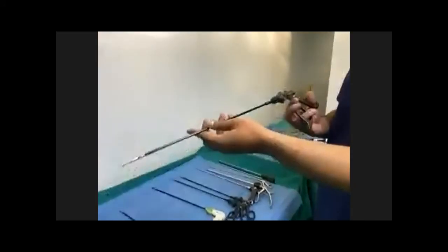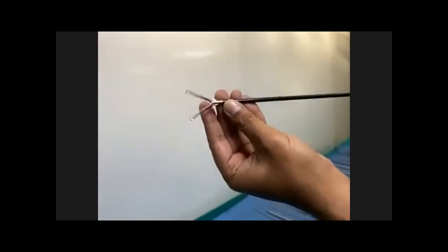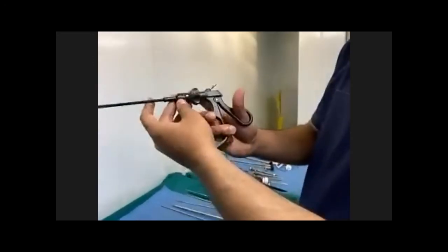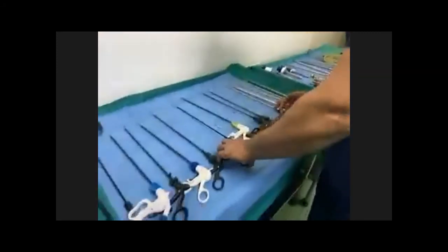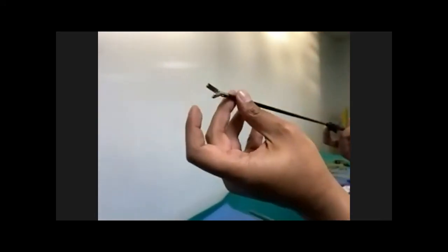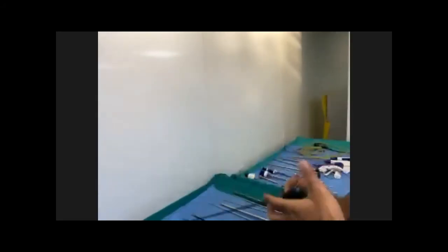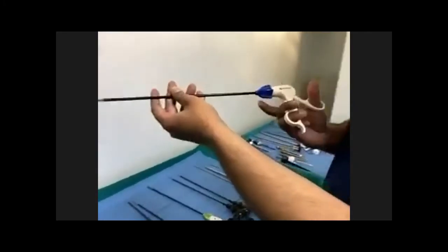This is another grasper without a lock, and you can see it is called a Babcock. It has exactly the same shape as the open Babcock. You can see it is a double action one. It is usually used to grasp the bowel. It also has a rotating knob, and you can apply a cautery over here if required. So this is another grasper with a very sharp edge to hold instruments, to hold viscera or take some small biopsies, right, tightly. It is also without lock. This is another instrument with lock, having double action, right?